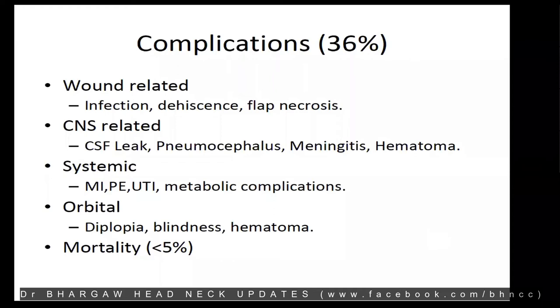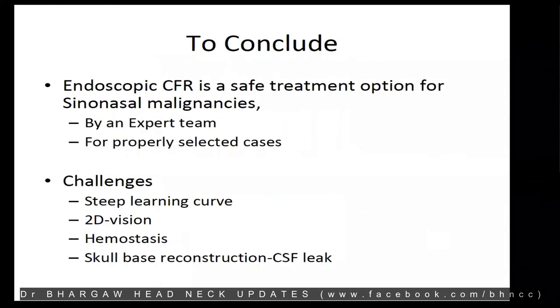And regarding CSF leak rates in many series, especially single institution series, where surgery is being done with experienced hands, the CSF leak rates have been far lesser. It has been less than 10%. So to conclude, endoscopic CFR is a safe treatment option for sinonasal malignancies, with a caveat that it is done by an expert team and for properly selected cases, with all the indications and contraindications that we have discussed.